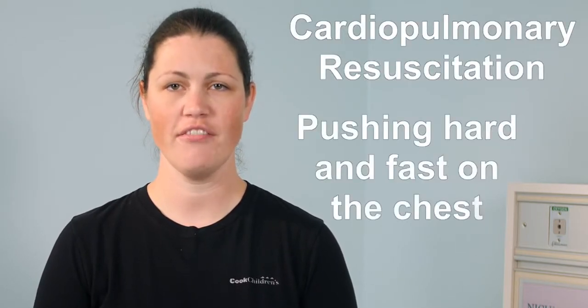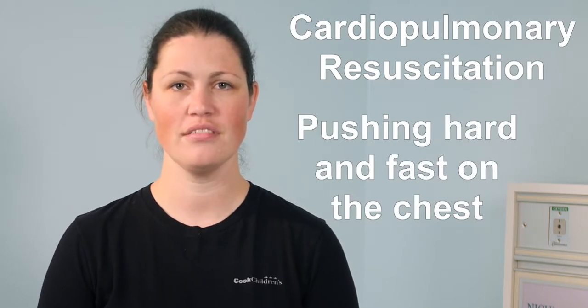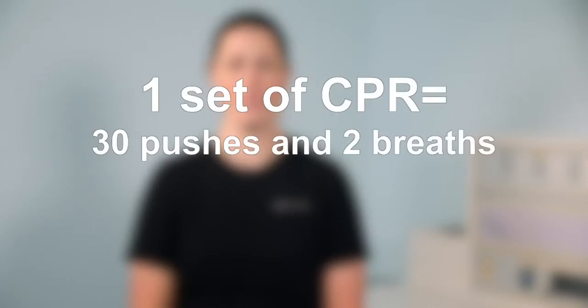The following instructional video will teach you how to deliver effective CPR to your child with a tracheostomy. CPR stands for cardiopulmonary resuscitation. CPR is the act of pushing hard and fast on the chest and giving breaths to someone whose heart has stopped. One set of CPR is 30 pushes and two breaths.